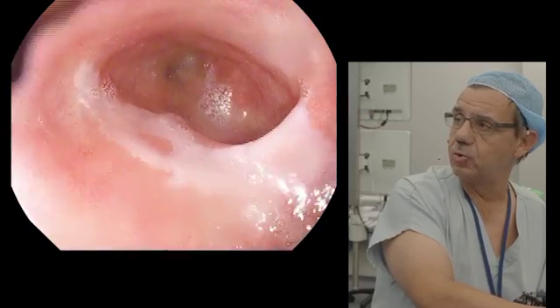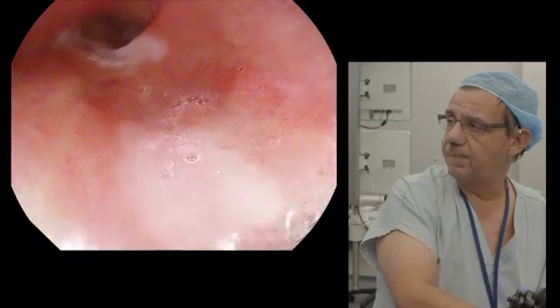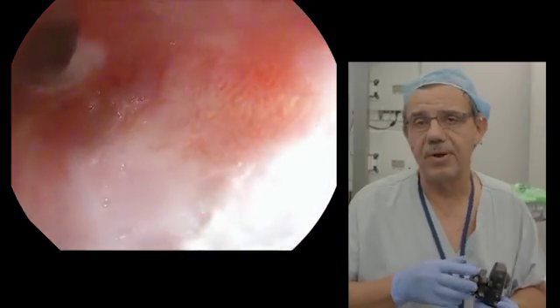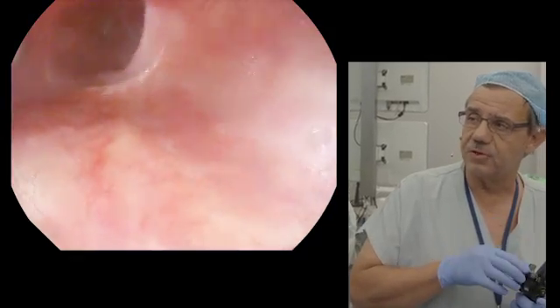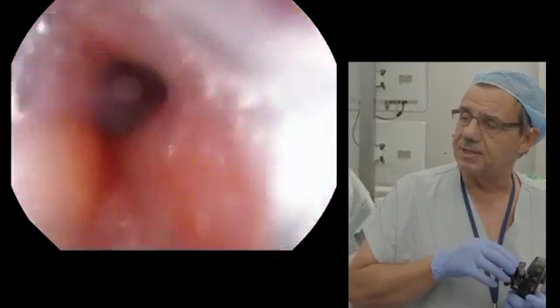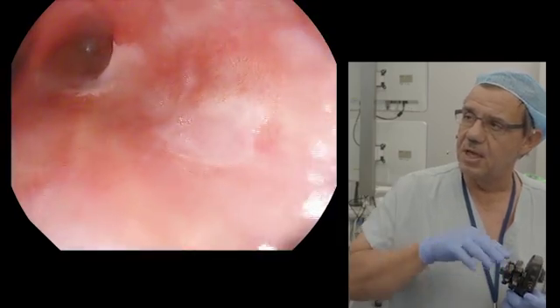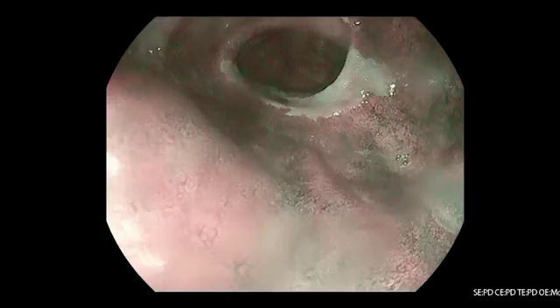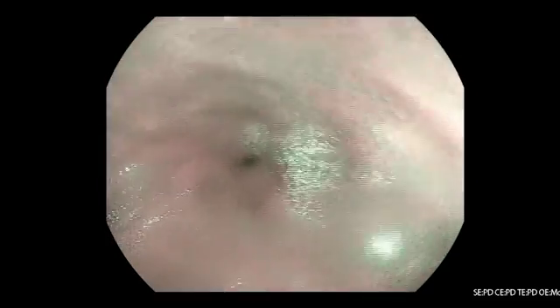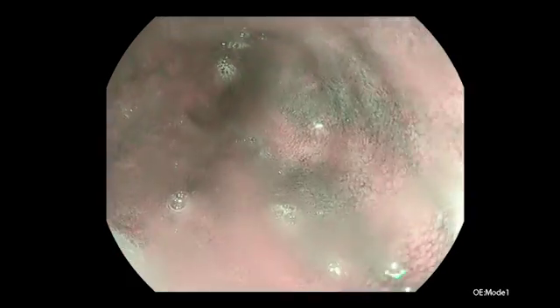Today we plan to do resection of the half part of this Barrett esophagus, and I will do the second part two months after. This kind of technique prevents the risk of esophageal stenosis if I perform a circular resection. But before, I will try to target the area of high-grade dysplasia using the optical enhancement.